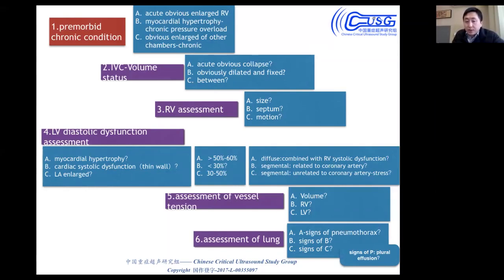And we'll assess if the patient has diffuse depression of the systolic function, or if the patient has regional motion abnormality. That means different kinds of disease cause such a dysfunction.